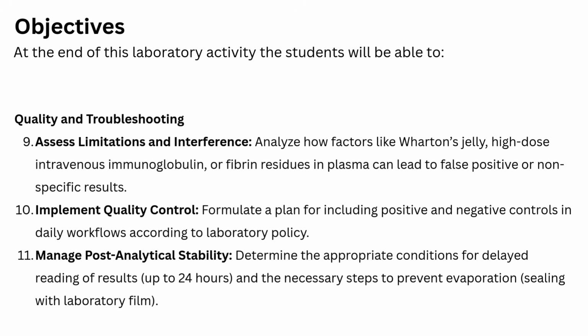And another major objective is based on quality and troubleshooting. So the ninth specific objective will be to assess limitations and interference. So analyze how factors like Wharton's jelly, high dose IV immunoglobulin, or fibrin residues in plasma can lead to false positive or non-specific results.